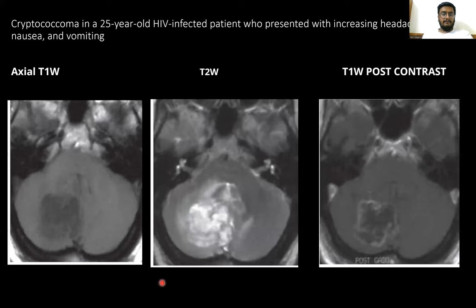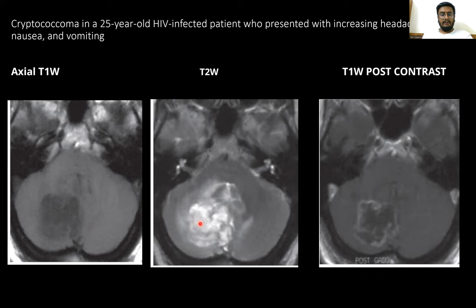Here is another case of a 25-year-old HIV patient presenting with increasing headache, nausea, and vomiting. On T1-weighted axial image, the right cerebellar hemisphere shows a hypo-intense lesion. On T2-weighted image, there is a hyper-intense lesion surrounded by perilesional edema. On T1 post-contrast, peripheral ring enhancement is seen.